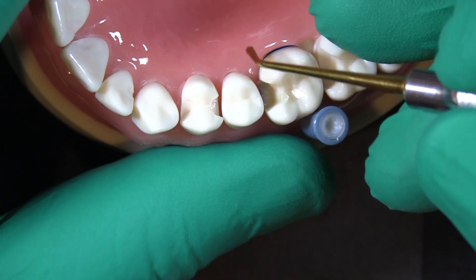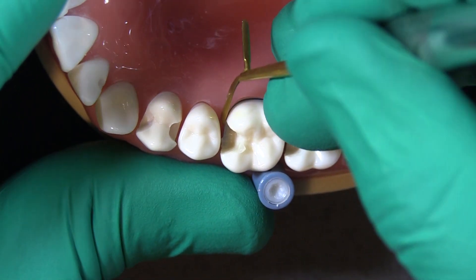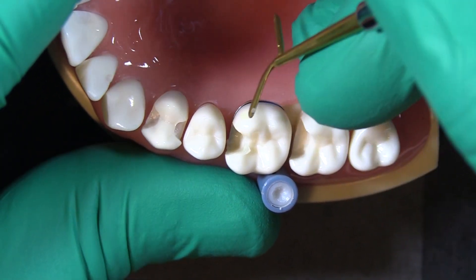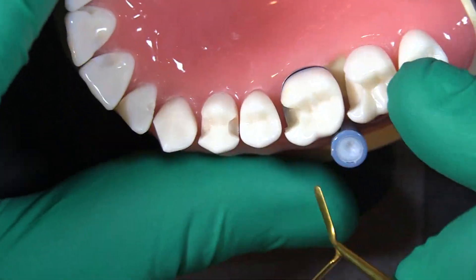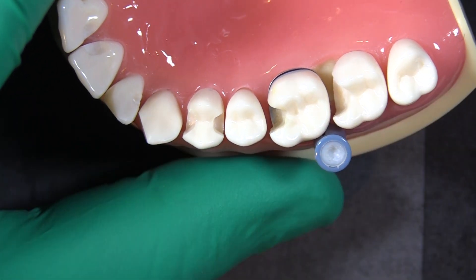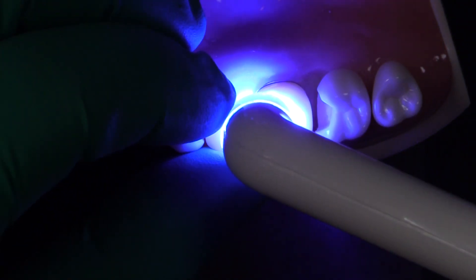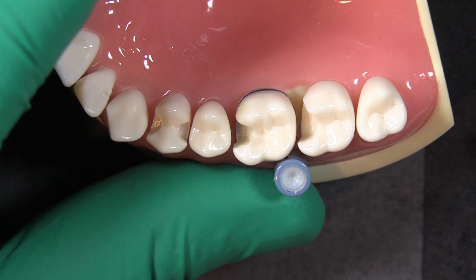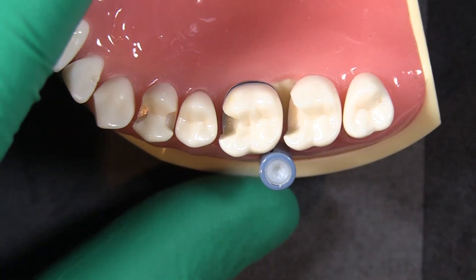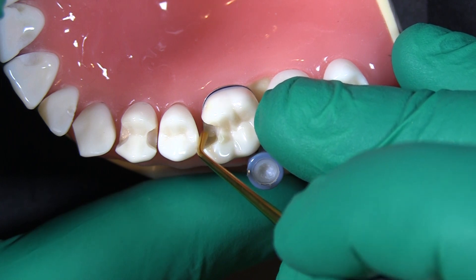We don't want to see that little overhang on the edge — if you get that it's no big deal, just take an explorer or something and get rid of that. Okay, so we're going to cure this and then repeat that process until everything is filled to the height that we're comfortable with.